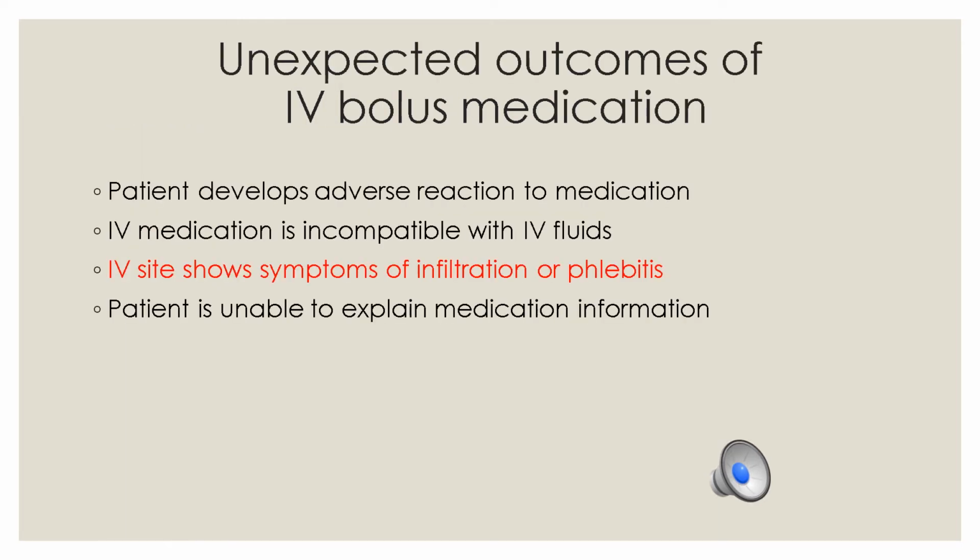Unexpected outcomes of IV bolus medication is that the patient could have an adverse reaction to the medication. So you want to stop the medication and notify the healthcare provider. We talked about medications possibly being incompatible with the IV fluids. If the patient shows symptoms of infiltration or phlebitis, so remember that. Infiltration, you'll see swelling and edema. Phlebitis, you might see some redness and also some swelling.